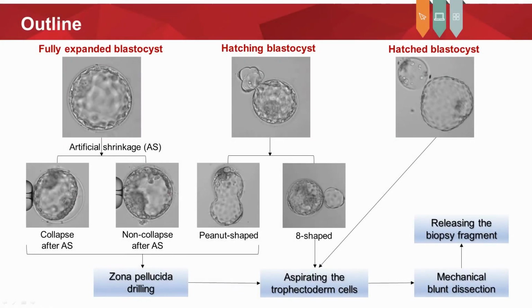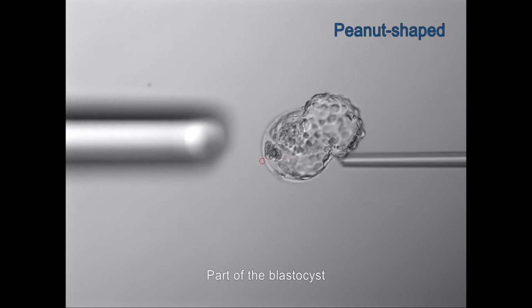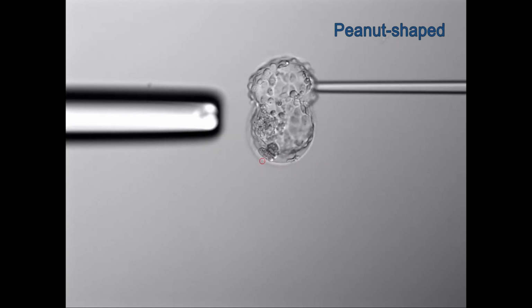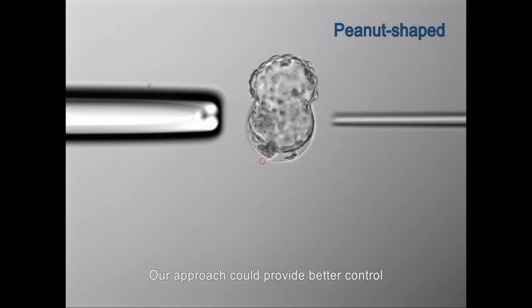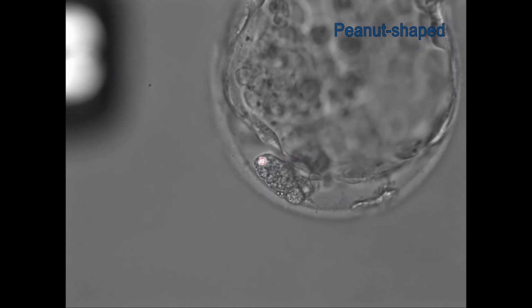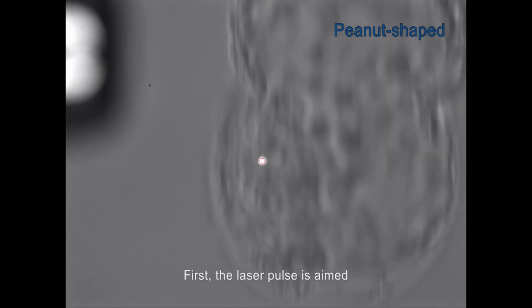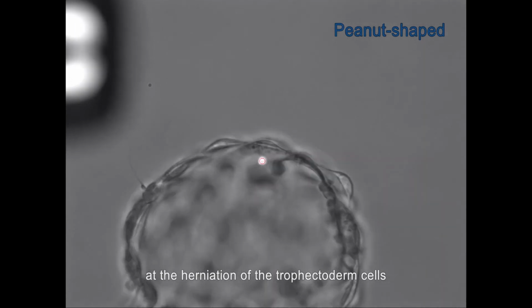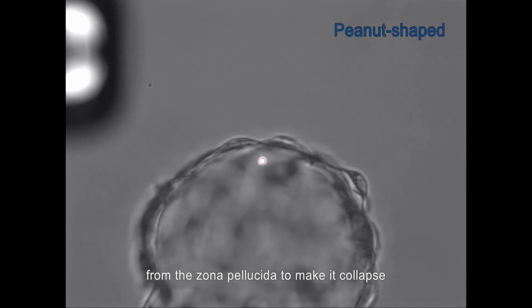For peanut-shaped hatching blastocysts, part of the blastocyst is herniated through the zona pellucida. Our approach could provide better control over the aspiration of trophectoderm cells into the biopsy pipette. First, the laser pulse is aimed at the herniation of the trophectoderm cells from the zona pellucida to make it collapse.